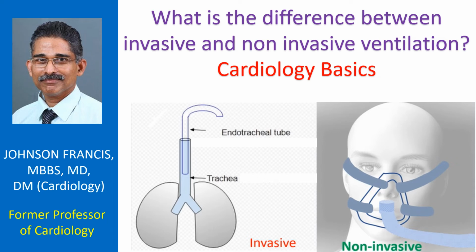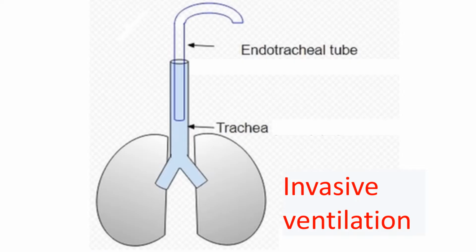Ventilator is a device used to support breathing. It is used when there is difficulty in breathing or when spontaneous breathing has stopped. Ventilator is an important life-supporting device useful in many life-threatening conditions. Invasive ventilator is usually used in the intensive care setting or the operating room.